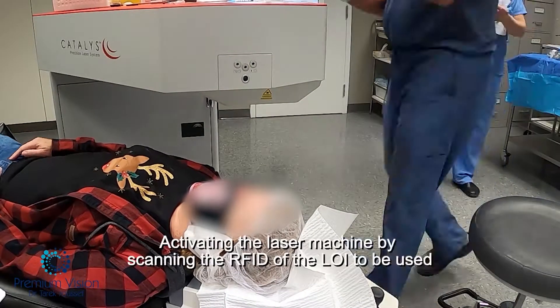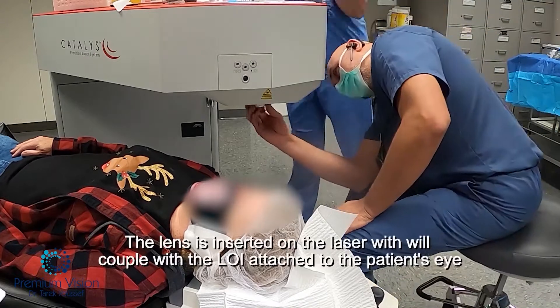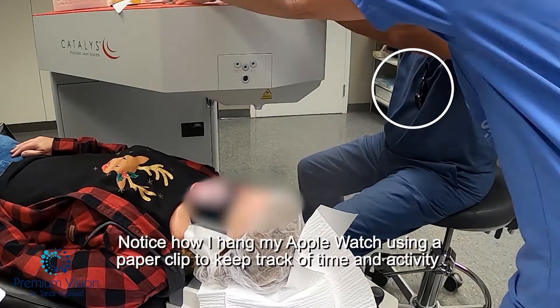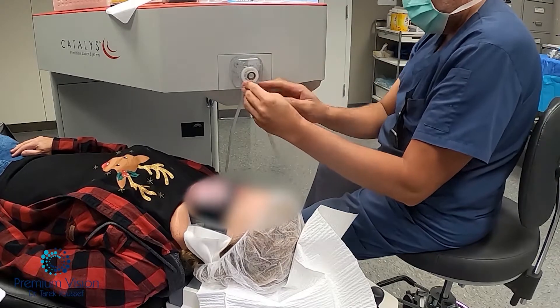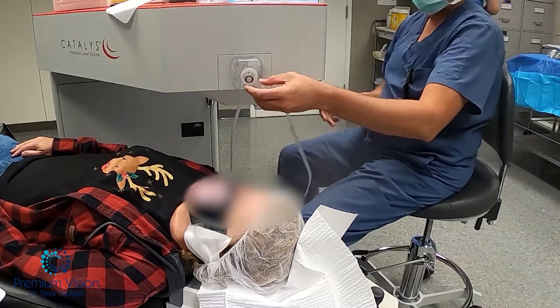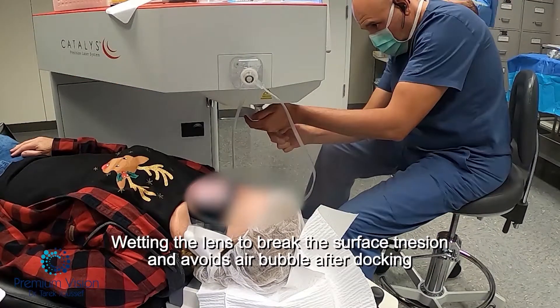Hi, I'm Dr. Youssef from Cornell, Ontario, presenting this bilateral simultaneous femtocataract extraction. I sped up the video five times so that it's a little bit more concise. I know how busy everybody is.